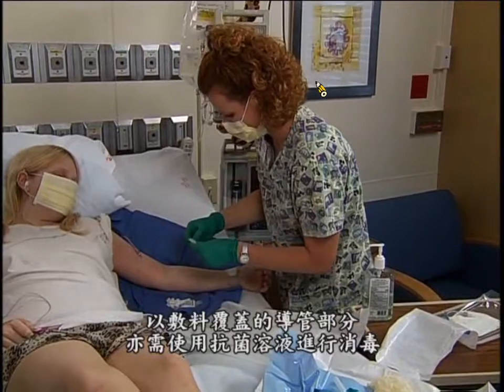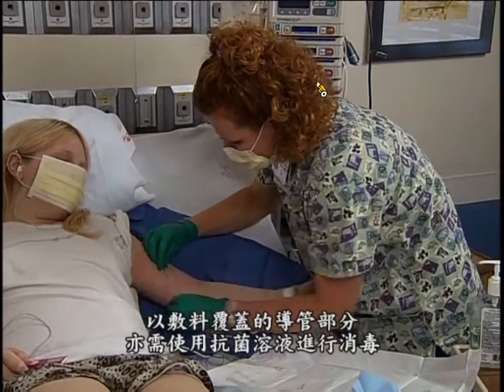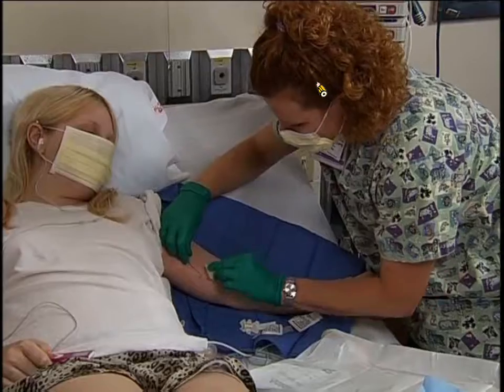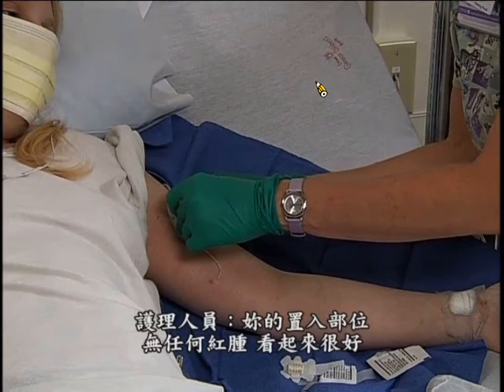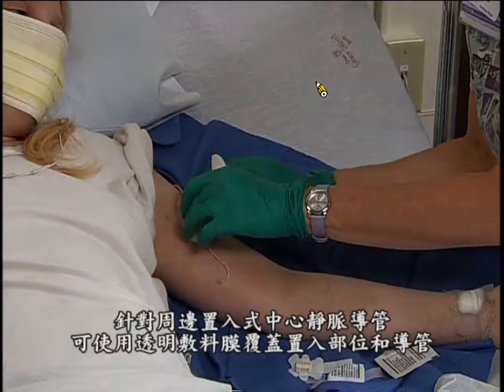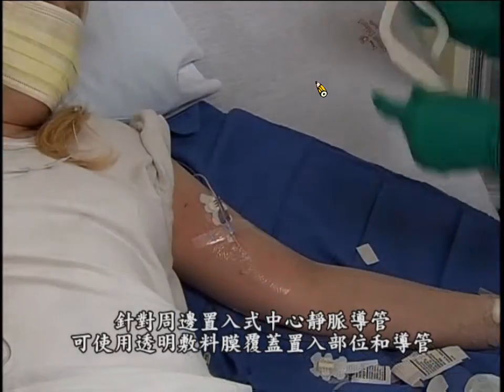Also use antiseptic solution to clean the part of the catheter or tubing that will be covered by the dressing. It's good you don't have any redness, any swelling. It looks great. With a PICC line, place a transparent dressing over the insertion site and catheter. Or, for an allergic child, a gauze dressing and hypoallergenic tape.